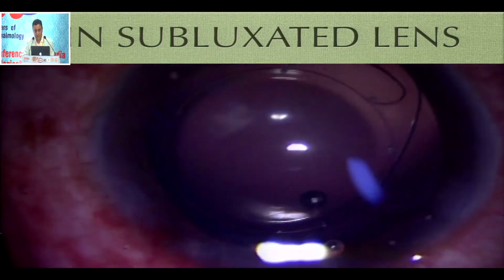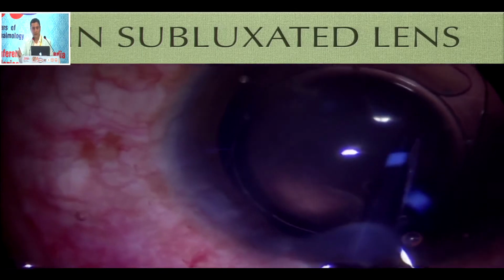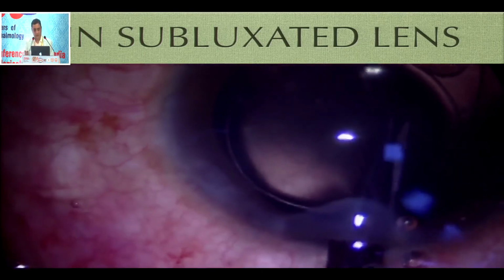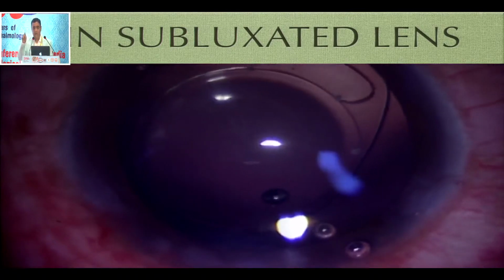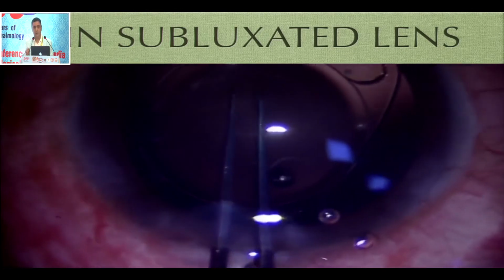Once that is done, rarely you'll see this in your life, that a femtorhexis is manually enlarged. So I'm actually enlarging it to the size of the optic, so you can make it about 5.5 millimeter and make it well centered. So again, my haptic is inferior in the same area of subluxation. I have my endocapsular ring there, which is an additional support, and this does quite well.